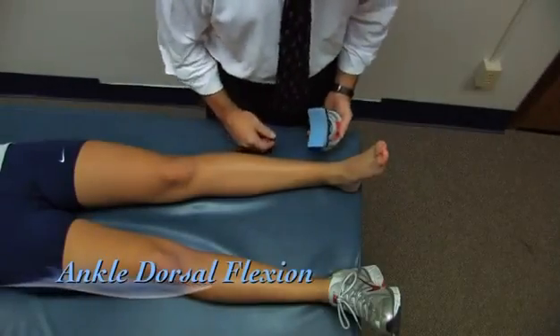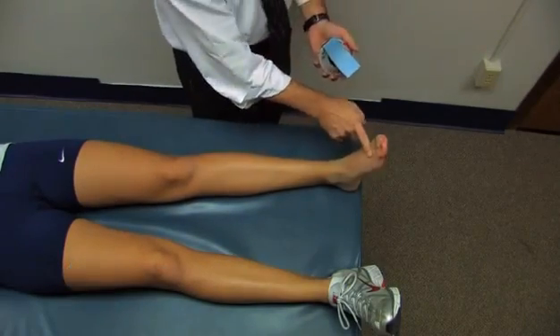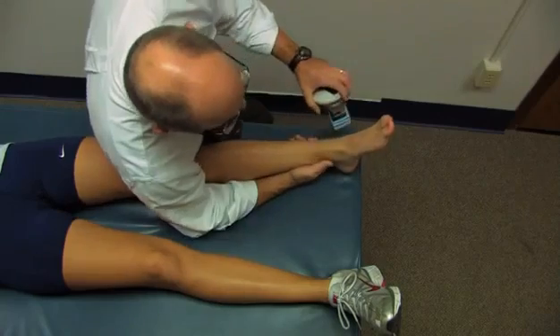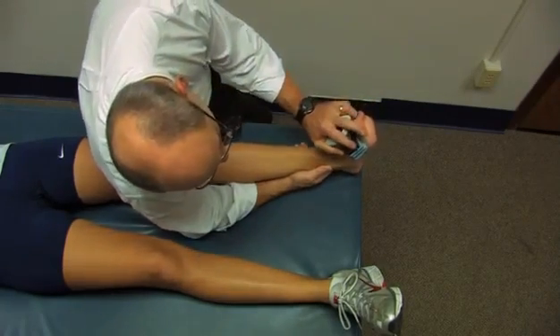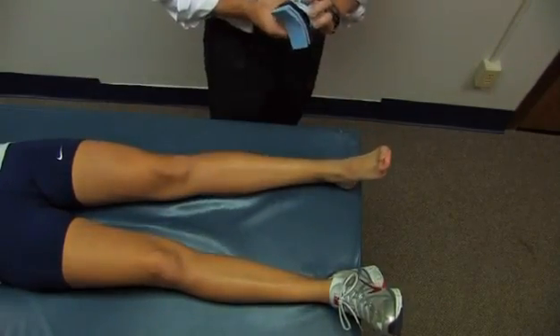Now we're going to measure ankle dorsiflexion — how vigorously she can draw her ankle up. I'm going to apply the device just proximal to the toes and stabilize by leaning over. She's going to take a second or two to come to maximum effort. Go ahead — pull it up, harder, harder. And relax. 53 pounds.